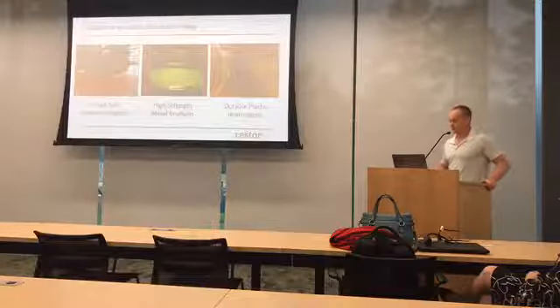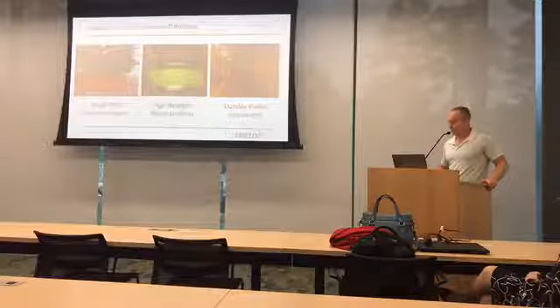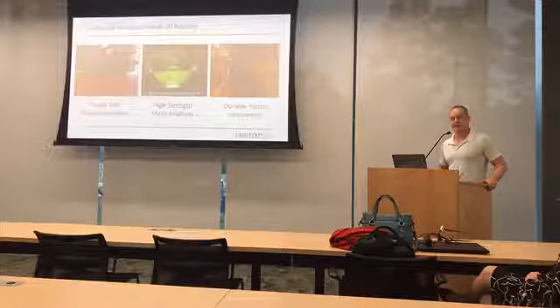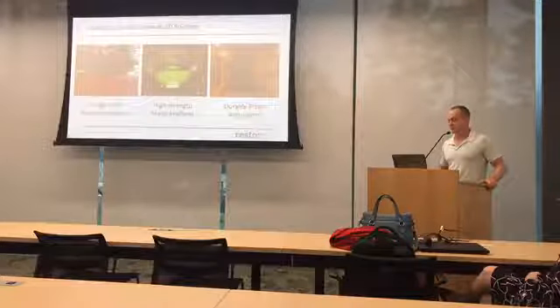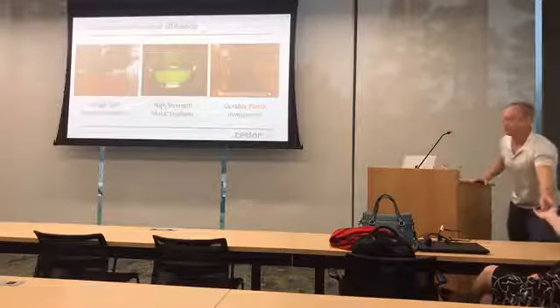So how do we do that? I'll just give you some examples of 3D printing. We print all kinds of different materials. The first one is polycarbonate urethane on the left. That's a high-strength elastomer. We print airway stents with that, so I'll pass that around. This is an example of that.